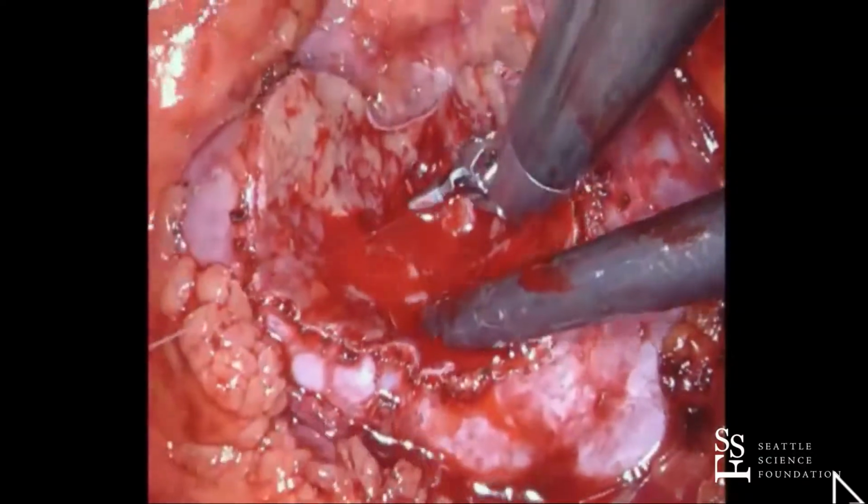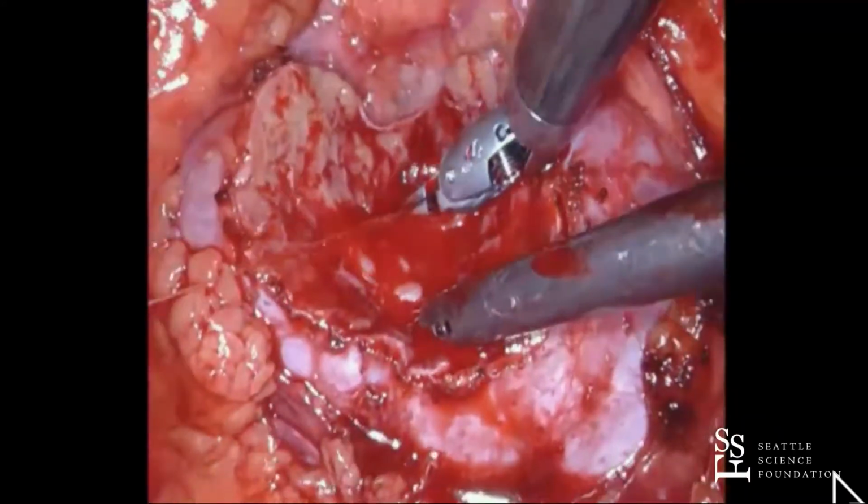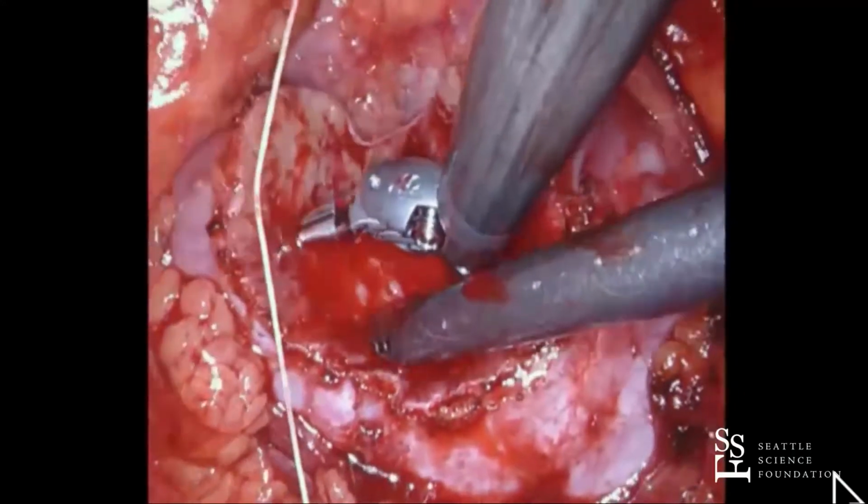So I like to close it. But this amount of bleeding, if we had just gone to our second layer, we probably wouldn't have even noticed this. Yeah, this is venous, really. There's no pumpers in there. This is not bad. There's something at the base there, which we're going to get.